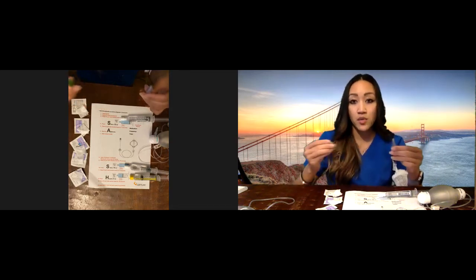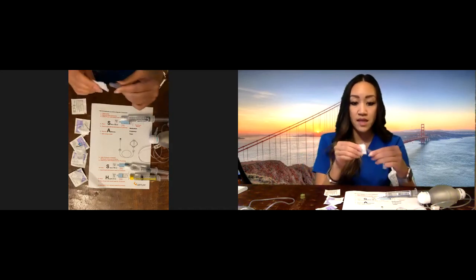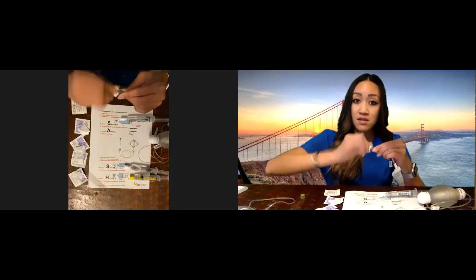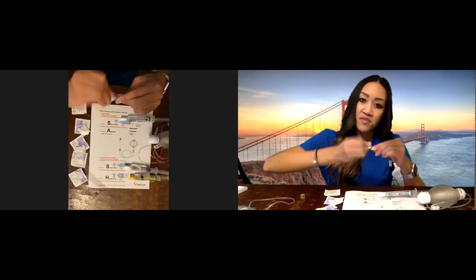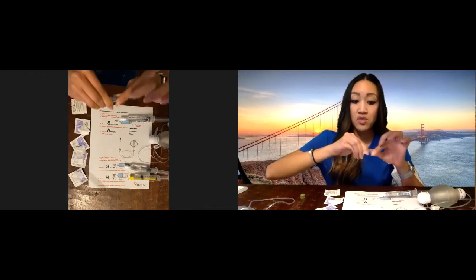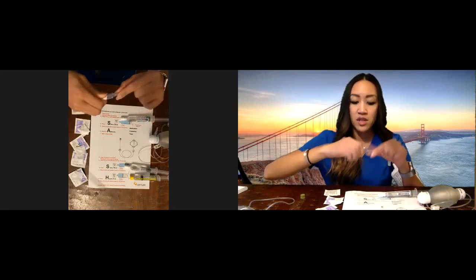Number three, we are going to clean the IV port with an alcohol swab for 15 seconds — that's equivalent to one happy birthday song. This is a nursing term; we call it 'scrub the hub' for 15 seconds. When you're cleaning your port, just be super careful that you don't disconnect the port from the PICC line.